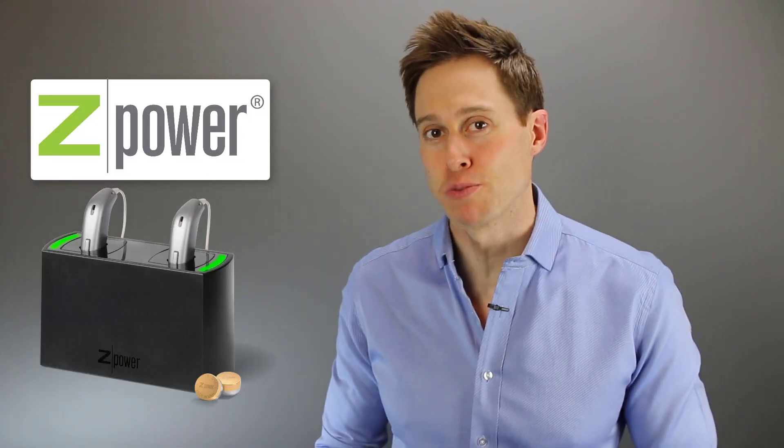In this video, I'm gonna give you five tips to get the most out of your Z-Power rechargeable hearing aid batteries.